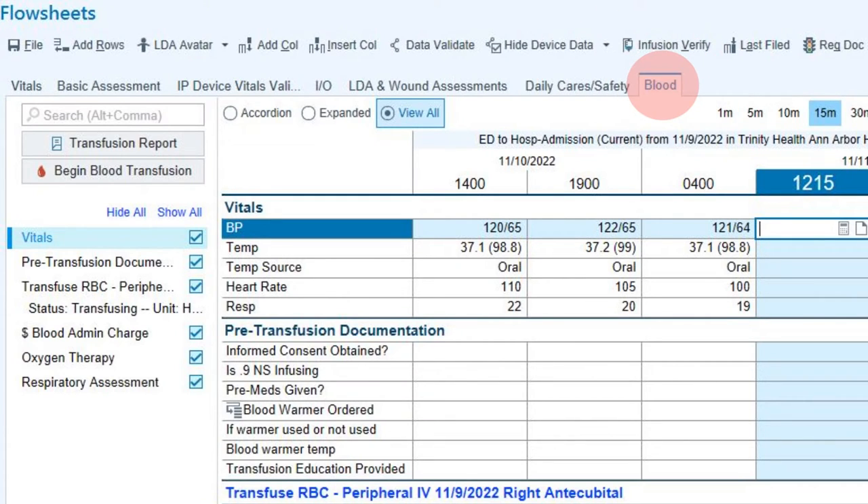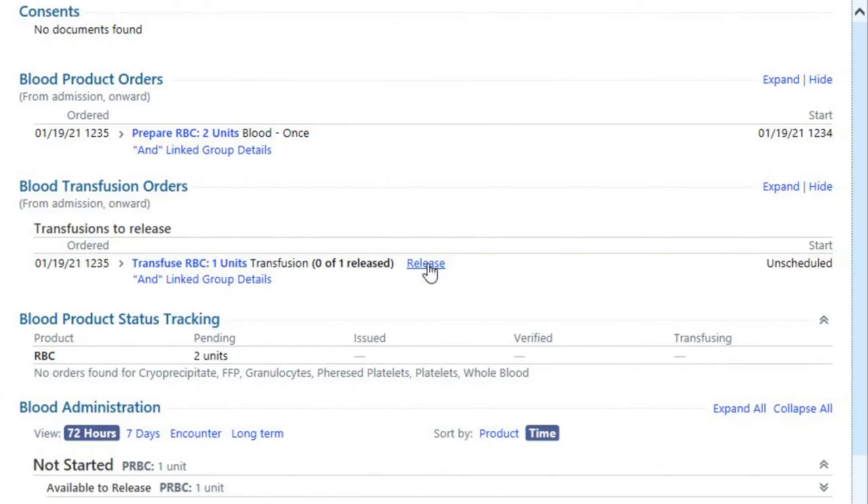You're now ready to release the blood product. Go to the blood tab in the flow sheets and click on transfusion report in the left column. A new window will open — click on the release hyperlink. This will prompt blood bank to send the blood to the floor.